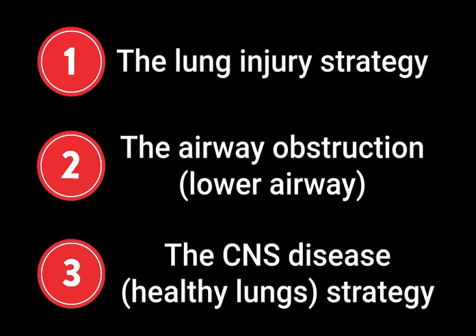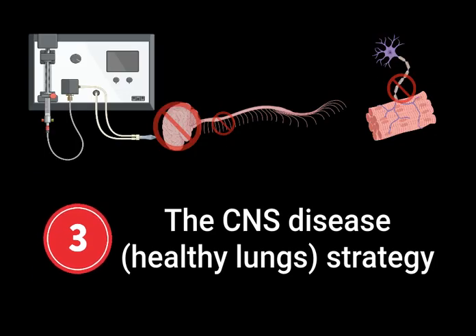The final strategy is used in patients with intracranial or diffuse lower motor neuron disease in conjunction with healthy lungs. This seems to be an easy strategy. However, it is deceptive, because if you use your ventilator in a wrong way, you may actually create lung disease that was not there in the first place. So it's important to follow safe ventilator strategies.